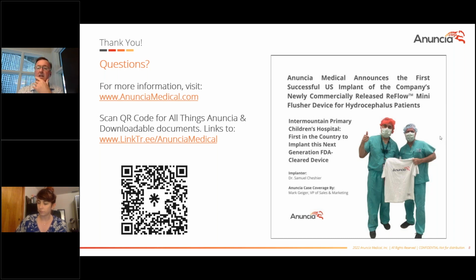There are 3, and they mostly center around whether it is just straight hydrocephalus, or whether there are other comorbidities associated with the hydrocephalus, like from traumatic brain injury or a tumor or a cyst or some of the other things that I've talked about over the course of this presentation. But it is covered under the existing DRG codes that the hospital bills for the implant or revision of a hydrocephalus shunt. Okay, that's great.